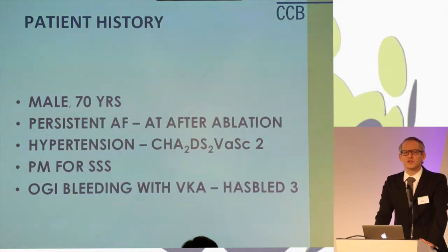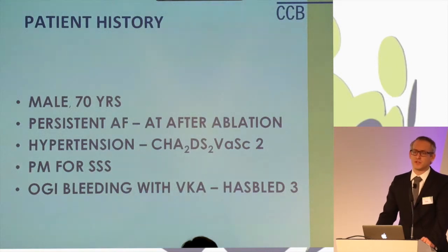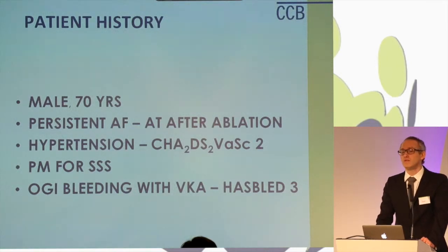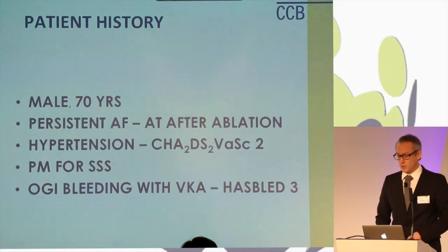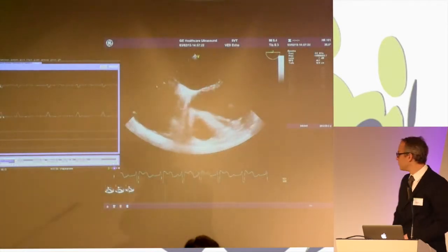In our lab, we don't do pre-procedural imaging. We bring the patients to the hospital and to the lab on the day of admission, and we don't even do TEE screening prior to the procedure. This is certainly debatable, but that's the way we do it. So we put the patient on the table, and we start the first movie.